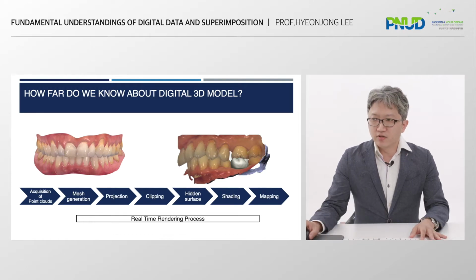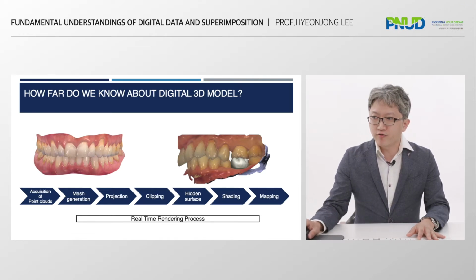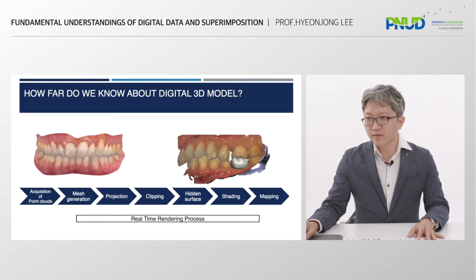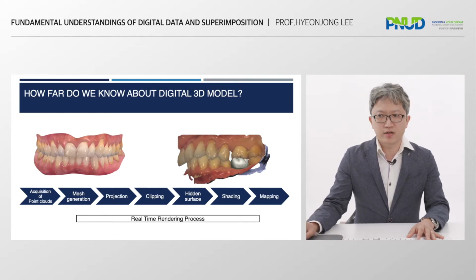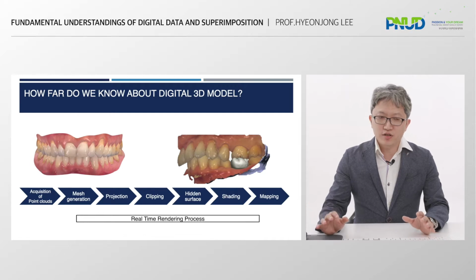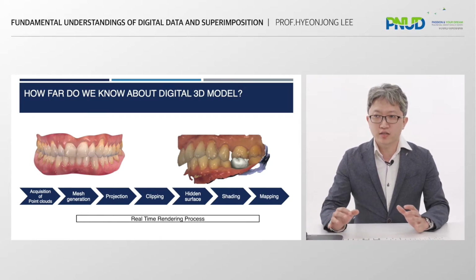Thanks to the development of CPU and graphic cards, the 3D intraoral rendered image is really closer to the real view. It looks really nice. However, it does not guarantee that good-looking 3D images are always accurate images. Sometimes when it looks good, it isn't accurate at all. So we need to know the whole process, how it is generated.